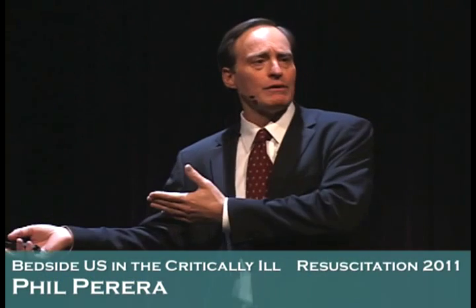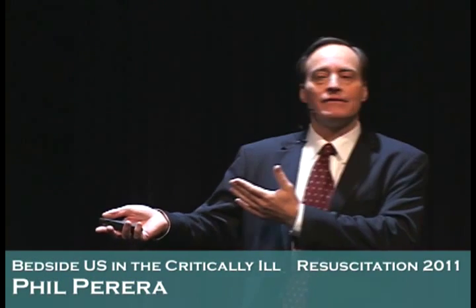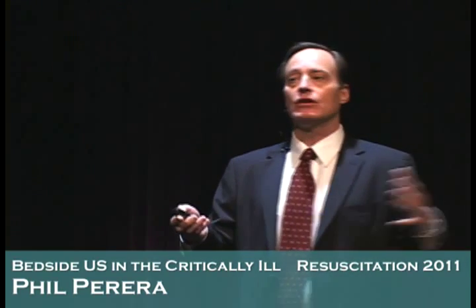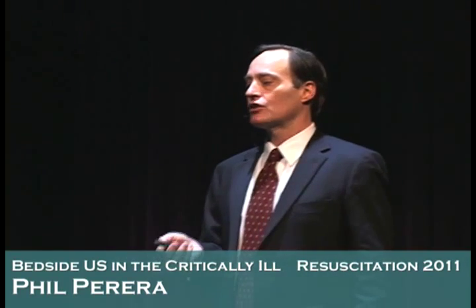So that's three units of blood to make a positive FAST. So kind of scary, but again, fitting in with that use of the ultrasound in the unstable trauma patient. But maybe we can do better than the 620 by looking in alternative places, as I'm going to show you.